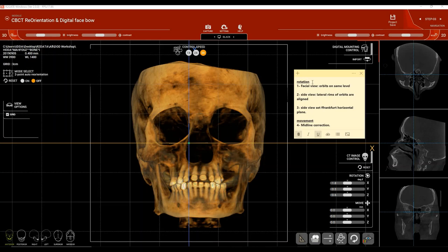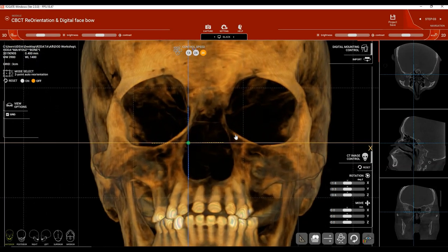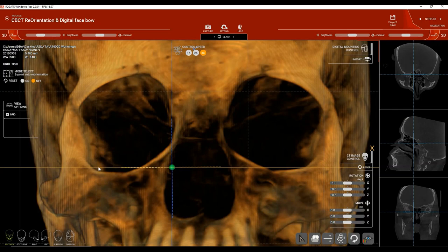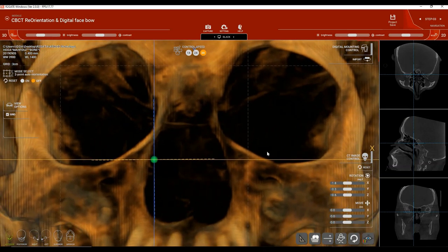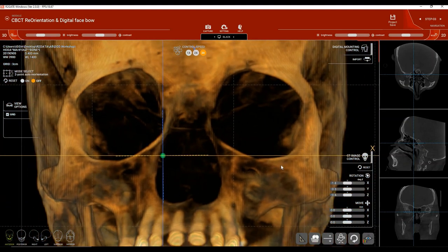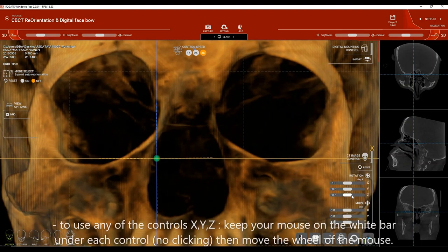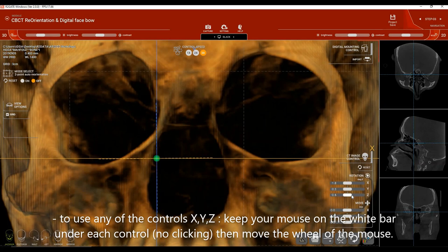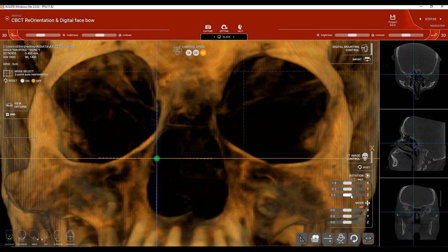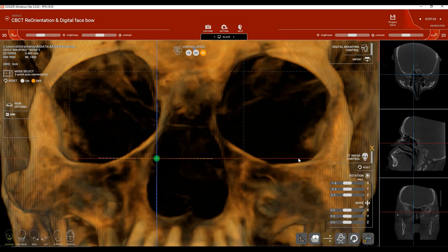To reorient the CBCT we do this in two steps — rotation and movement. Under Rotation, first look at the patient from a facial view to make sure both orbits are on the same level. If you zoom in, you may find the floors of both orbits are not on the same level. Use CTRL Z to tilt the patient's head so both orbits will be on the same level. Click the icon that says 'activate horizontal line control' to display a red reference line.